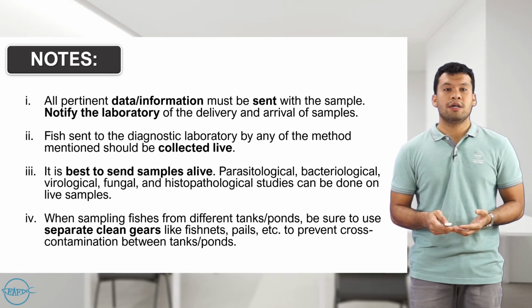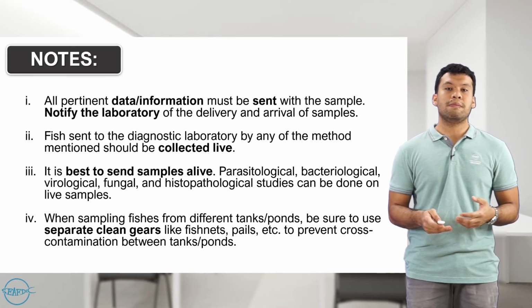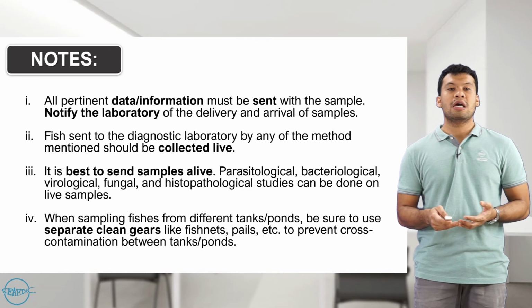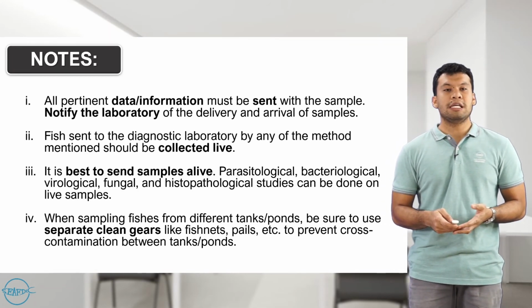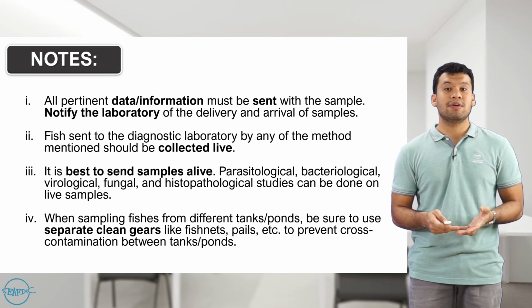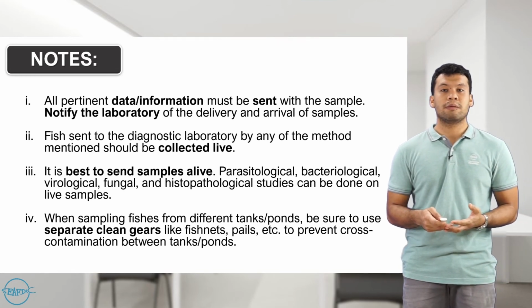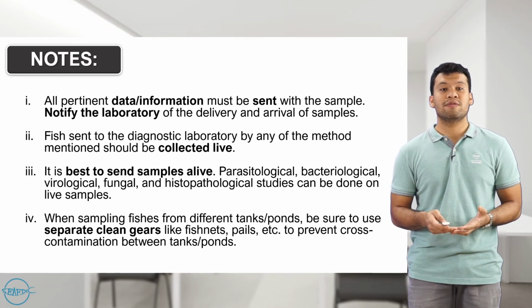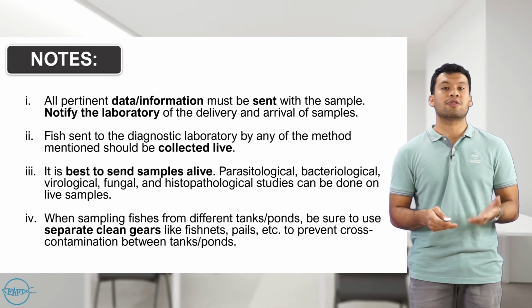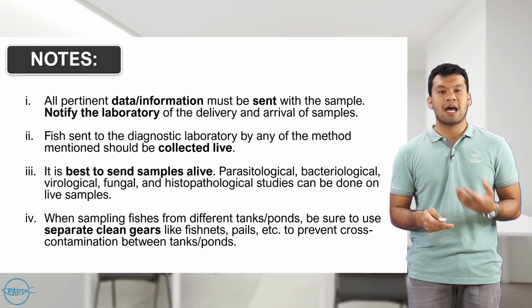Your fish or your biological sample should be sent to the diagnostic laboratory by any of the methods mentioned, but we usually prefer it live. It is best to send samples live for parasite detection, bacterial isolation, viral detection, fungal isolation, and histopathological studies that can be done on your live samples.